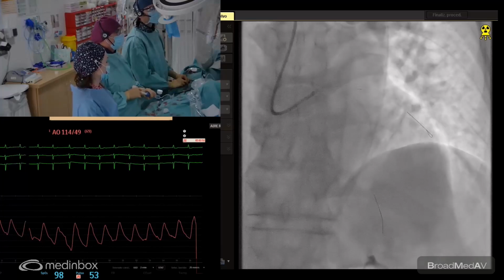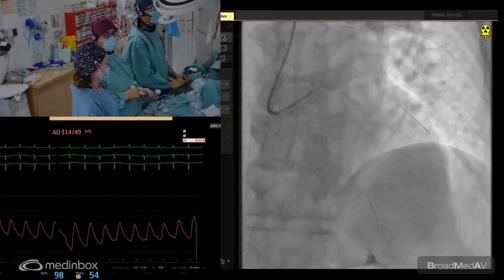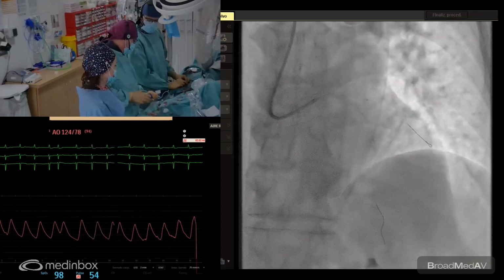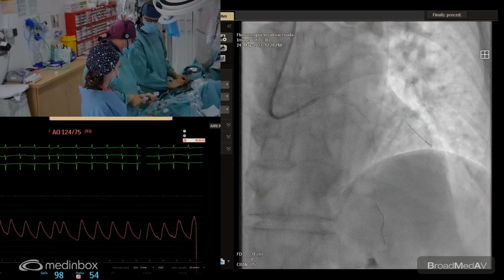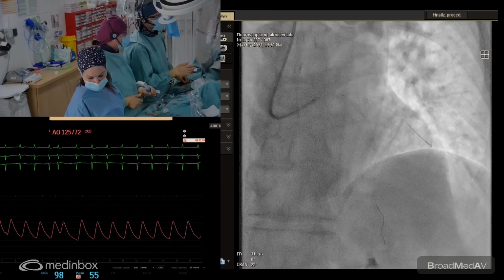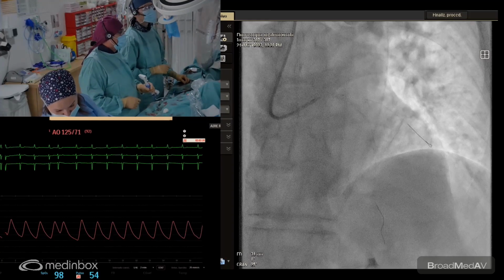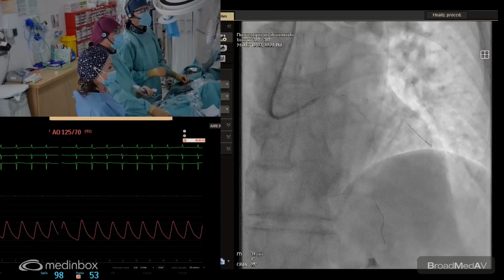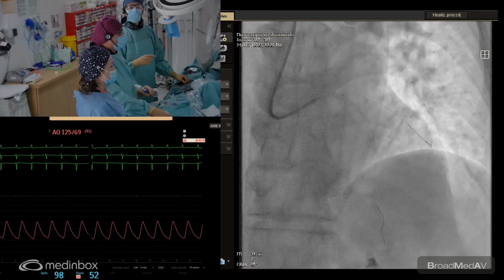Patrick, por favor, un test. ¿Cuál era el balón? Aquí, 6 atmósferas, más, eso es. So just here is a 2-0 balloon. Dale, 6. And you need to inflate it. The nominal pressure is 6. Okay, and just maintain 1 minute. You have there the chronometer.